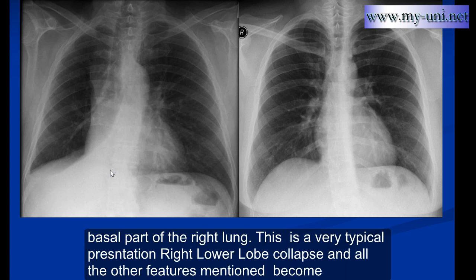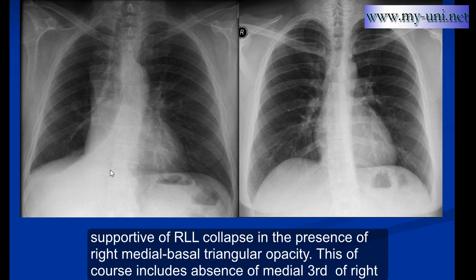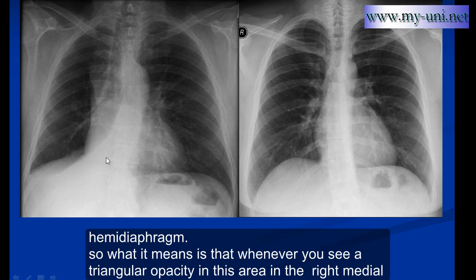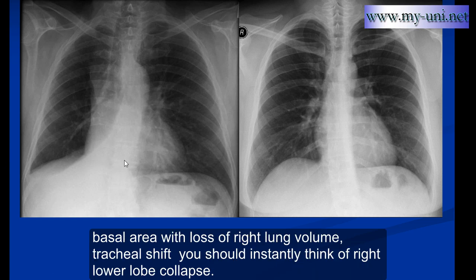This is a very typical presentation of right lower lobe collapse, and all the other features mentioned become supportive of right lower lobe collapse in the presence of right medial basal triangular opacity. This of course includes the absence of the medial third of the right hemidiaphragm. Whenever you see a triangular opacity in the right medial basal area with loss of right lung volume and tracheal shift, you should instantly think of right lower lobe collapse.